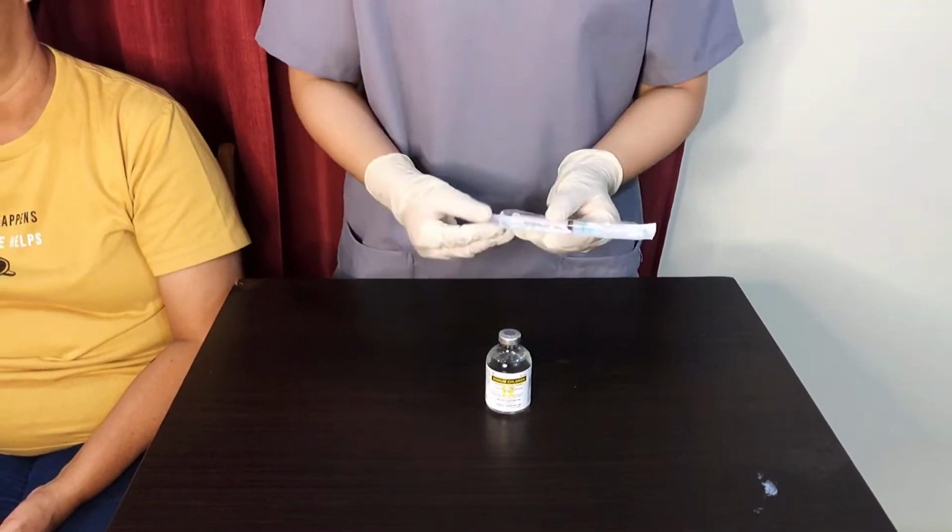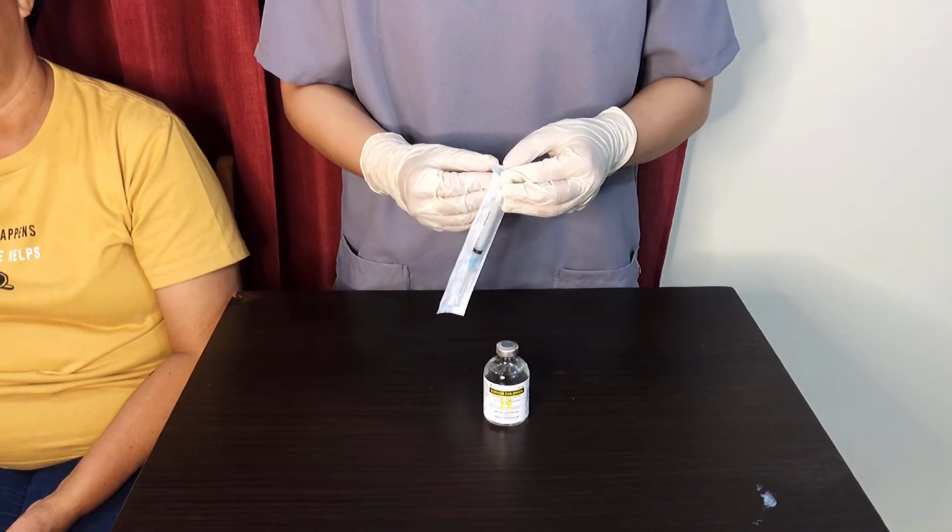At first, you must prepare the medication or solution.